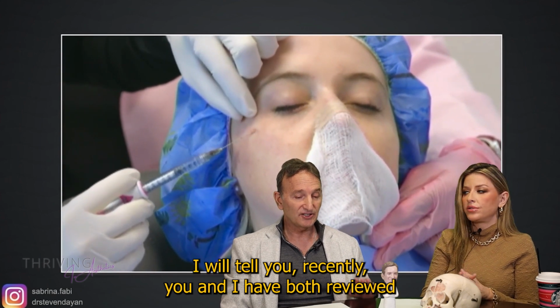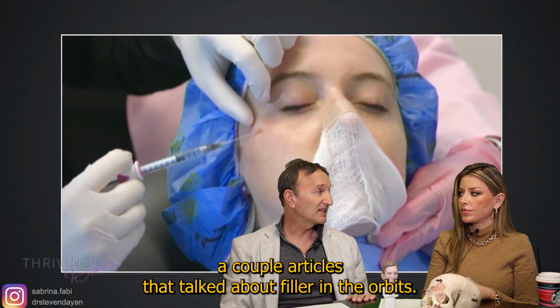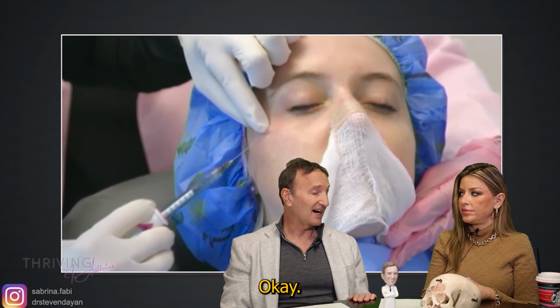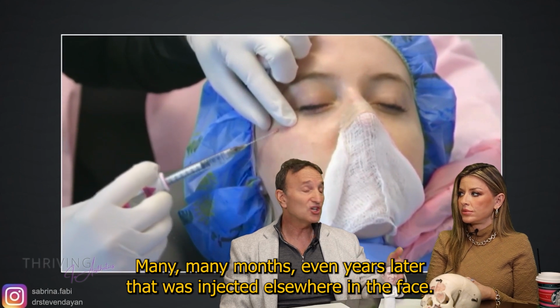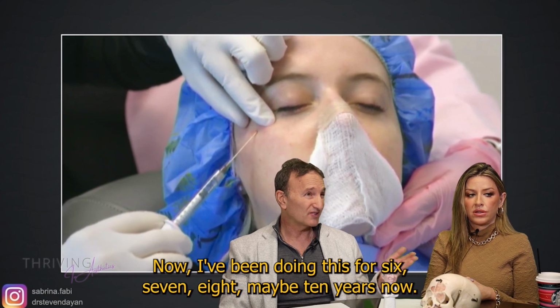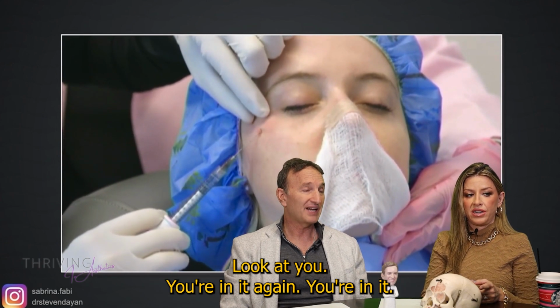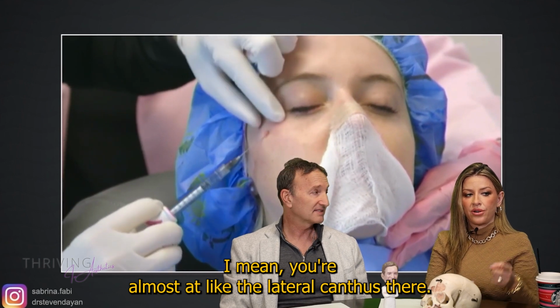Postseptal. Now I will tell you, recently you and I both reviewed a couple articles that talked about filler in the orbit many months, even years later, that was injected elsewhere in the face. Now I've been doing this for 6, 7, 8, maybe 10 years now. I've never seen it. You're in it again. You're almost at the lateral canthus there.